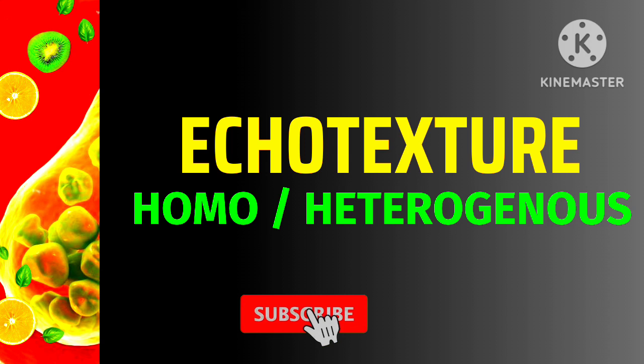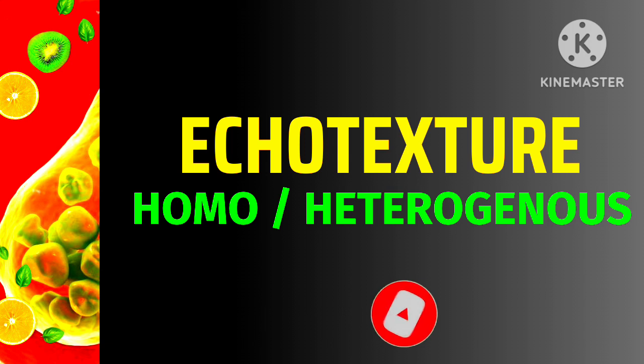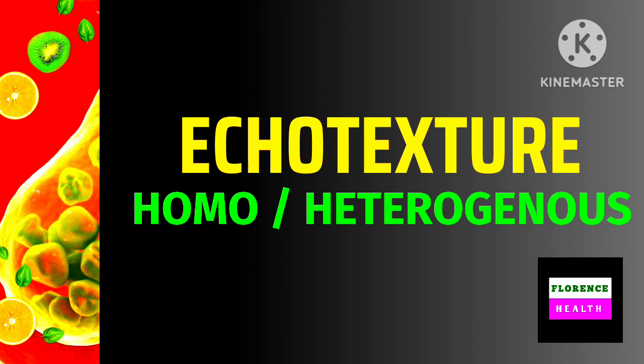I have already discussed echogenicity. Now let's discuss echo texture, which is divided into homogeneous and heterogeneous echo texture. Homogeneous echo texture is otherwise called fine echo texture, and heterogeneous echo texture is otherwise called coarse echo texture. Homogeneous echo texture means the same level of echo throughout an organ, that means the same level of echo from top to bottom of an organ. Heterogeneous echo texture means different levels of echo throughout an organ. Let's do this with an example.